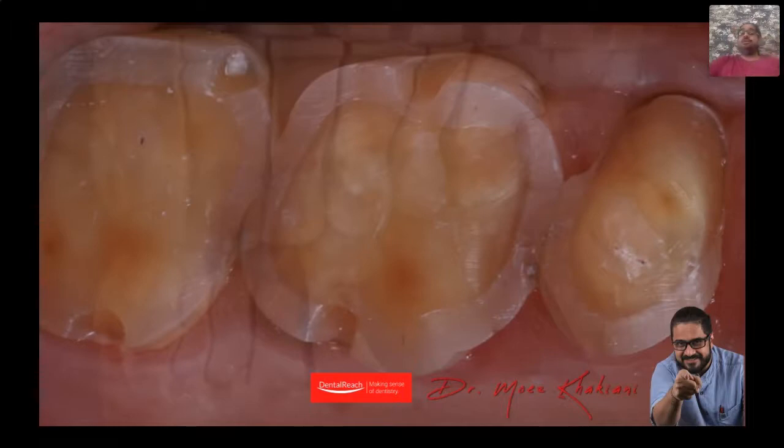Posterior overlays do not debond as long as there is enamel. And be rest for sure, they do not fracture under function. By themselves, they may be weak. But once you bond them to the underlying tooth, they are superlatively strong. I am more confident today doing this for a bruxer than doing a PFM or a PFZ or, worst case scenario, monolithic zirconia, because I am scared that will cause more problems over a period of time than porcelain, which is a replacement for enamel.